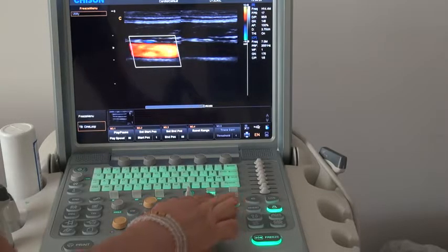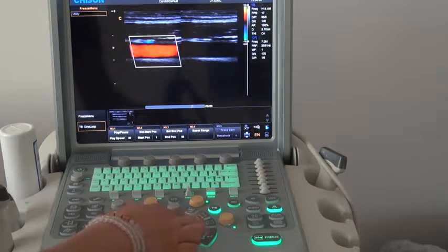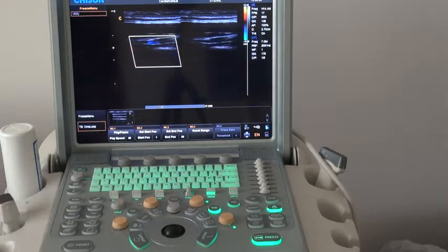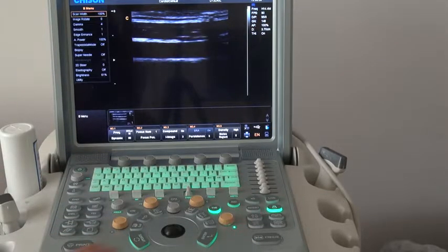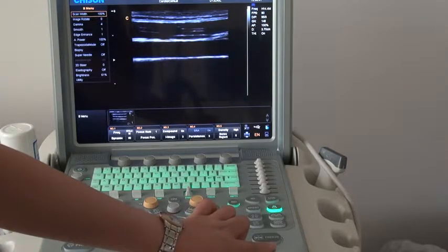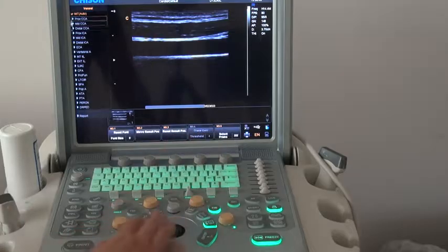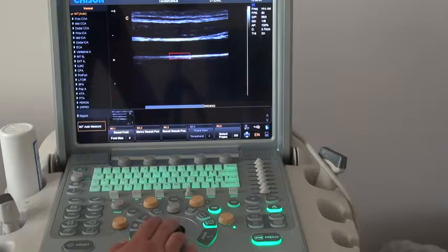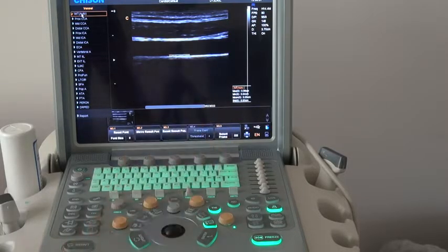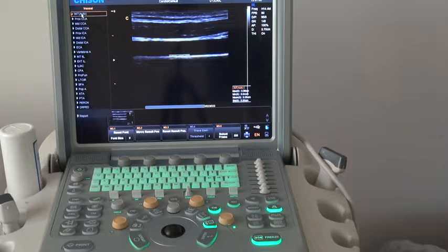Also, for this control panel, this is the measurement area — this one is distance, this one is trace, and this is the calculation package. For intimal thickness measurement, freeze the image, press the calculation key, and you will find the IMT auto function. Press it and choose one area to measure the intimal thickness. You will find the maximum, minimum, and mean values displayed at the same time on the screen.